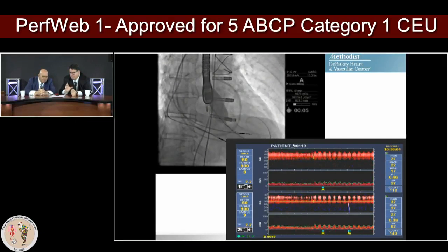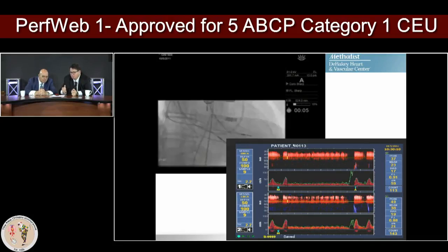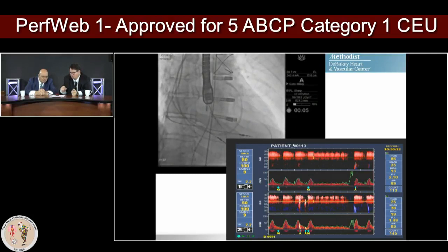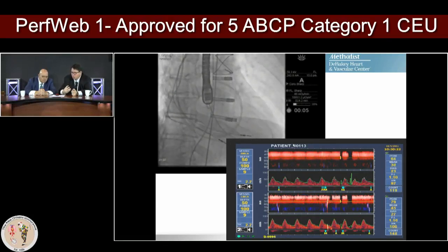And again, you need to deflate your balloon before you stop the rapid pacing. And then you're lucky that you stopped the rapid pacing, the heartbeats came back. This is a great example of how the BAV goes, but you also see that the diastolic velocity gives us a clue how good was this BAV, how good is the valve implantation, how good is the end-diastolic perfusion for the brain.